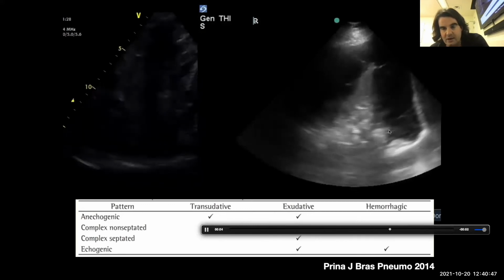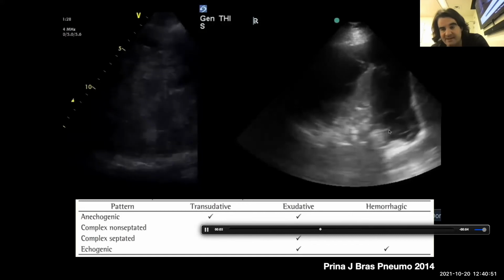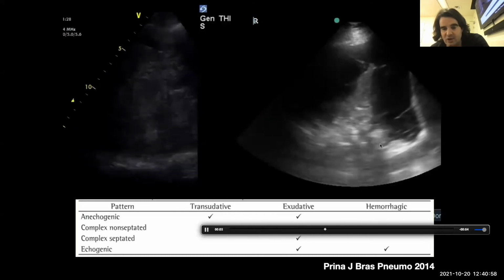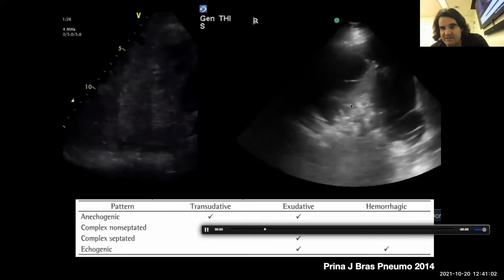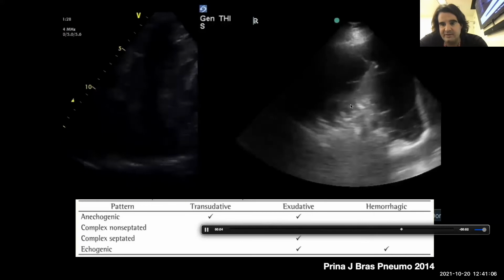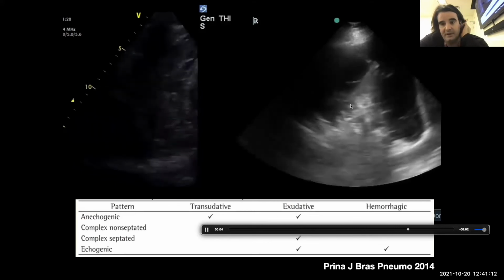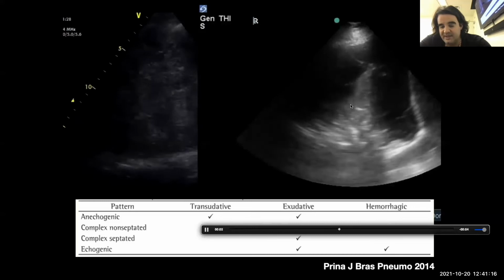about why that's there. For example, if they've had a previous chest surgery, maybe that's chronic, but if their chest has never been instrumented before, and they're coming in with a fever and a white count, that would be much more impressive. So in case 2, that was where I was coming from. This patient has not had a previous thoracic surgery, and comes in with this elevated white count, very pale, diaphoretic, and frankly, very ill appearing, that I felt this was more likely to be exudative and empyema versus anything.